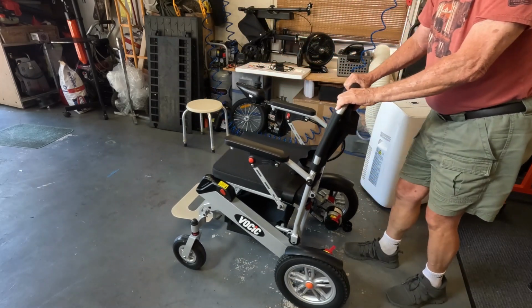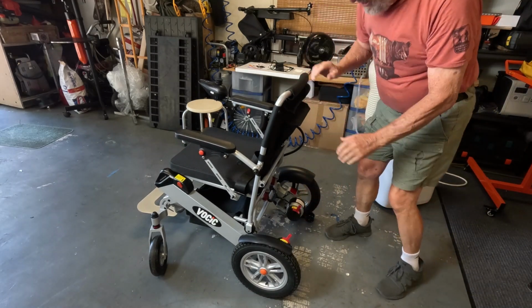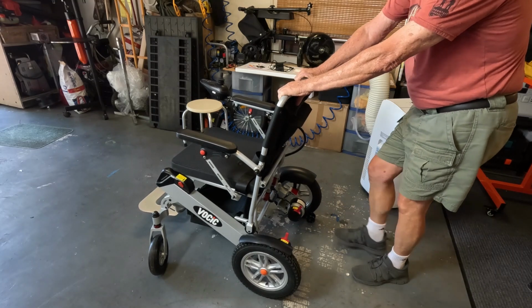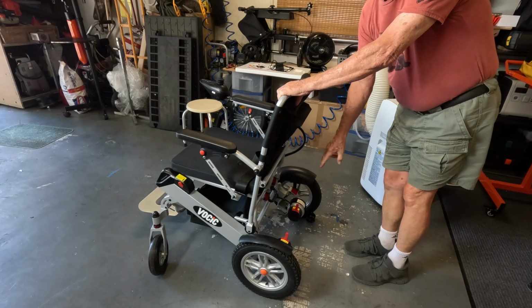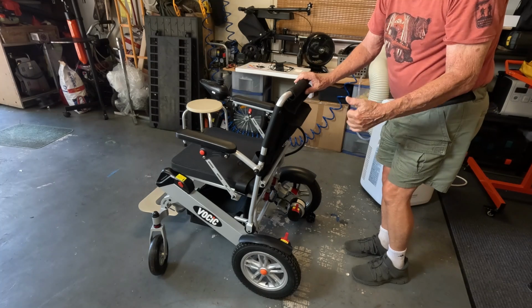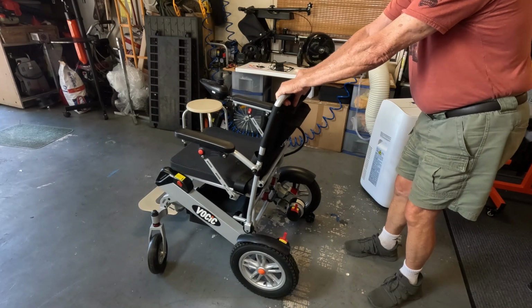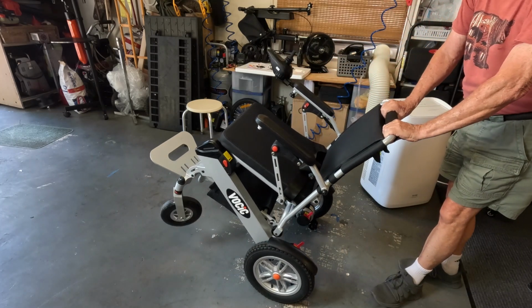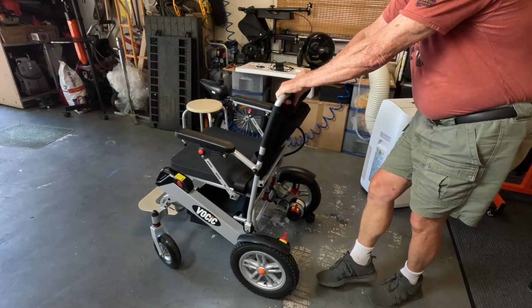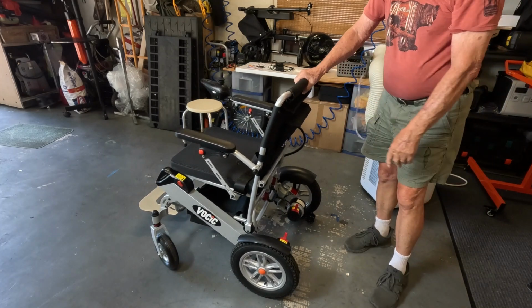Now, we're going to do a little test drive, so to do that, I'm going to pull both of these up, and you can do your foot like this, push that one up, and then this one. They always have to be in the same position, either drive or neutral. Right now, it's in drive. You can't push it. Now, you see the anti-tip wheels, that's what does that. If I went down further, it wouldn't go as far, it would stop about there. So you adjust that to your needs.